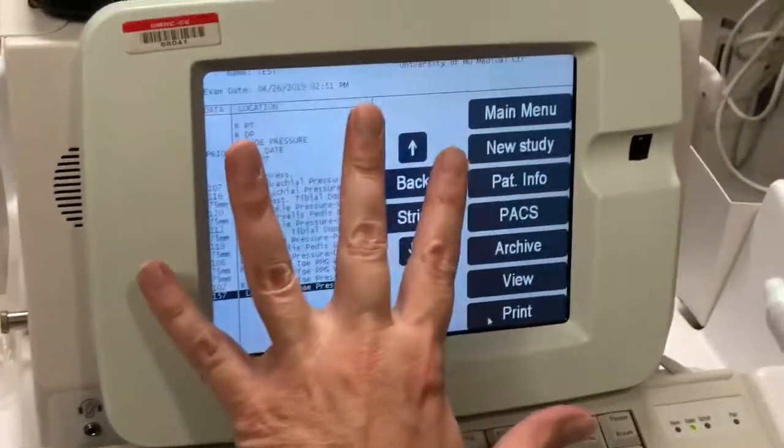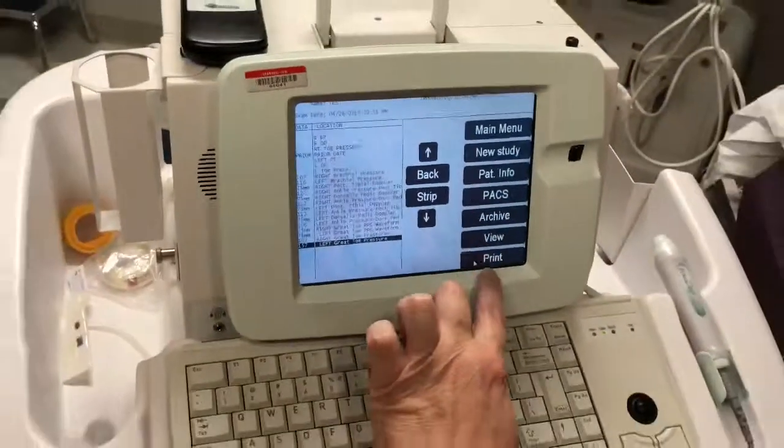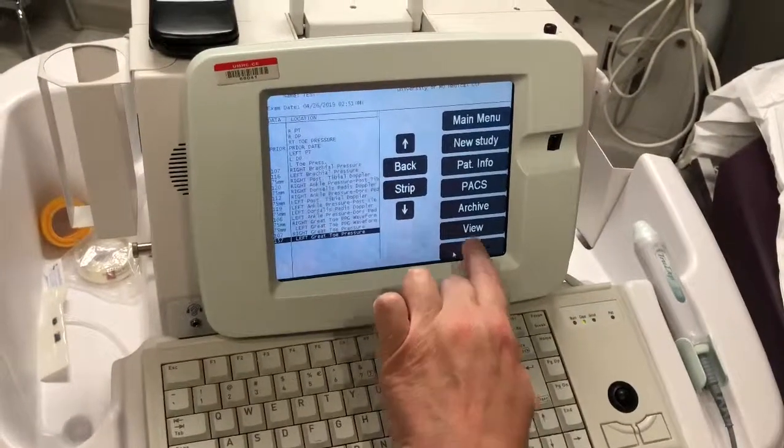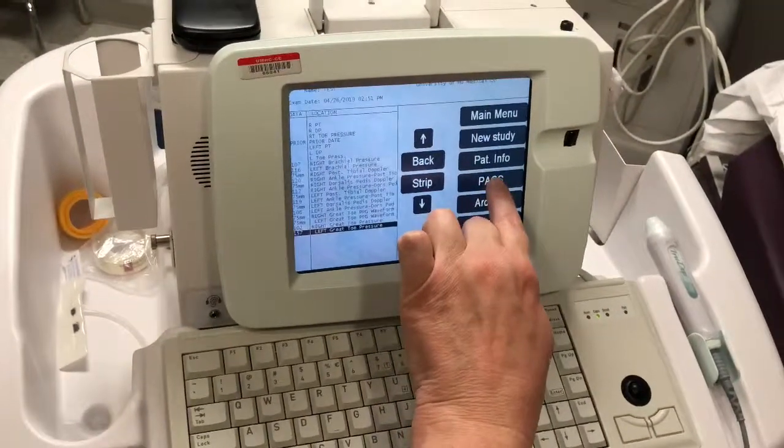The study is now over. You can send this information to a printer and you can send it to your PACS.